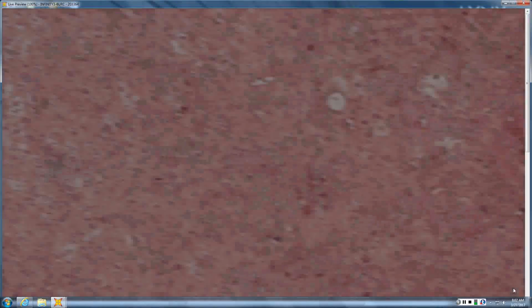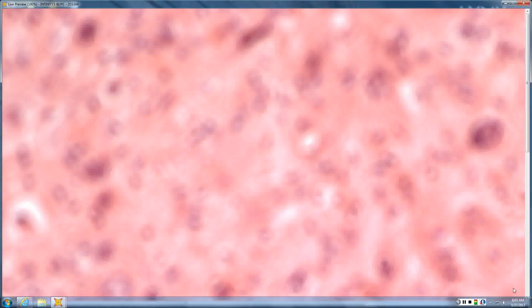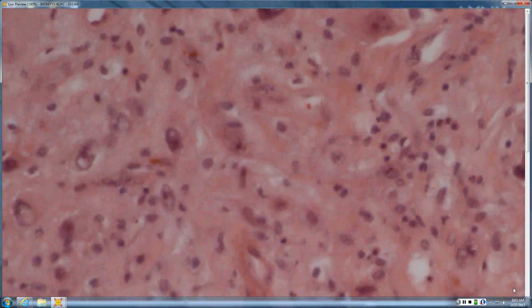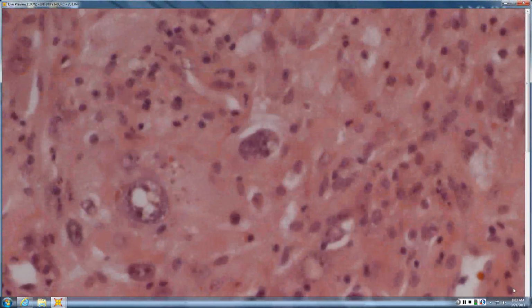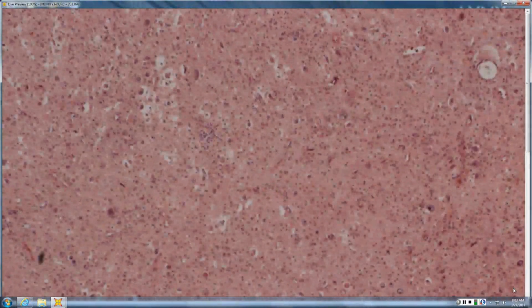Looks like it's probably another ancient one. So, it certainly has a lot of atypia, but this one has mitoses as well. How comforting is that? Not. What's the history? Do they have a plexiform NF? Do they have a history of NF? Well, it's a patient with von Recklinghausen, and now there's a big hard mass.